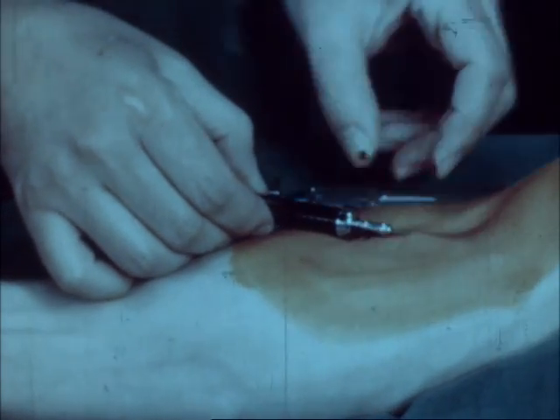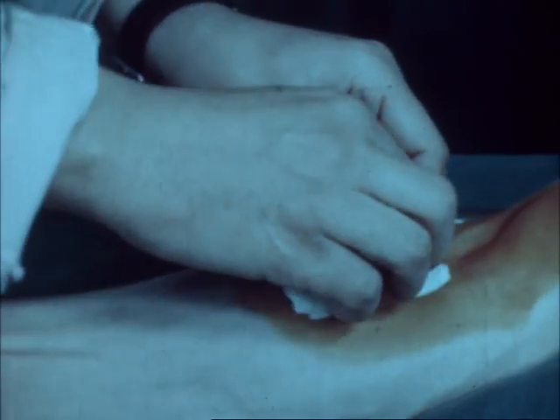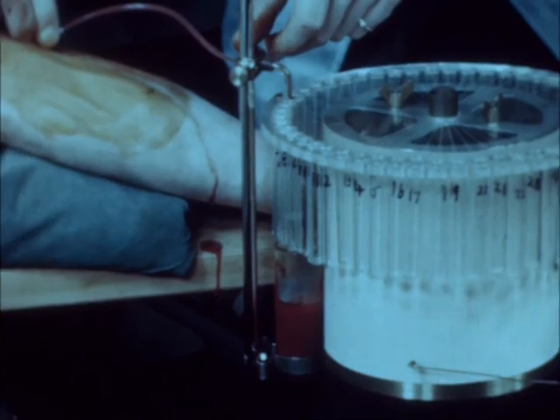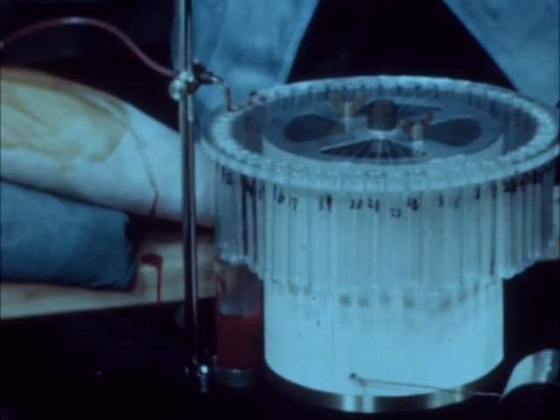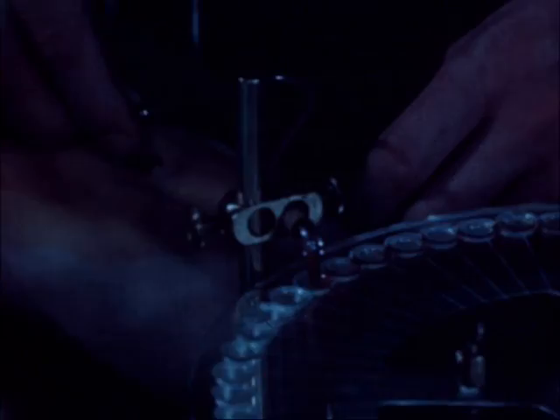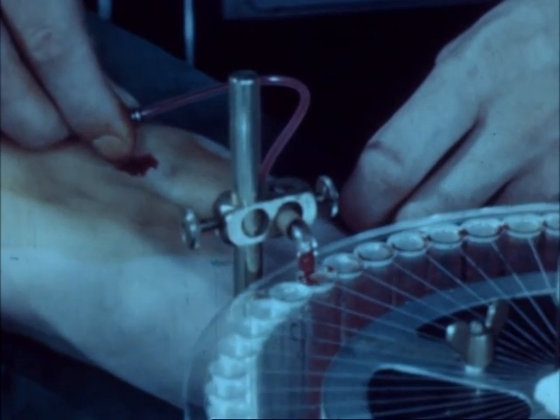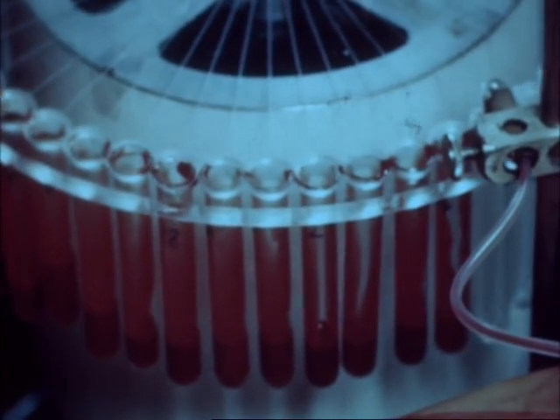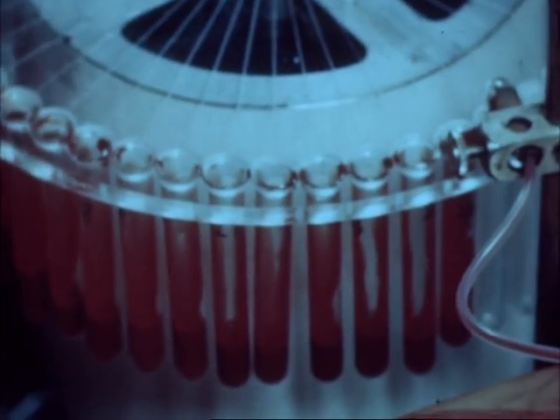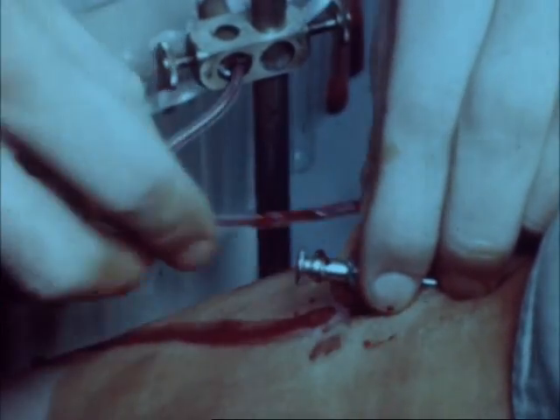The syringe containing the dye is then attached. As the injection is made, the time is marked by a signal on the revolving drum, and the collection of samples of arterial blood is begun. These samples are accurately timed by reference to the time marker scale. When a suitable number of samples has been obtained, as judged from experience of the type of case, collection is stopped and the arterial needle closed by a stilette.